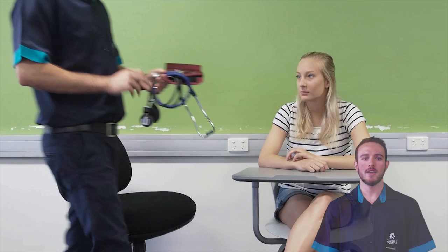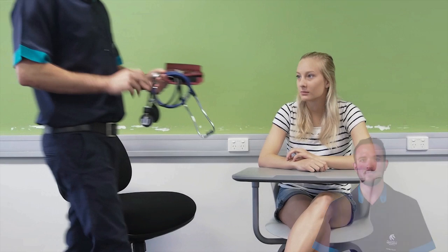Once you have consent, gather your equipment and prepare the environment. As usual, perform hand hygiene. Okay Nicole, I've got all the equipment we need. I'm just going to go wash my hands and I'll come back and be with you in just a moment.